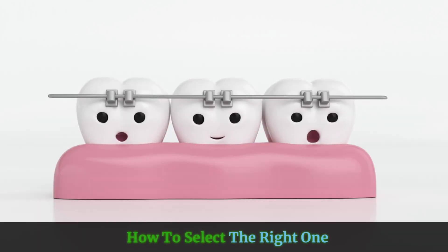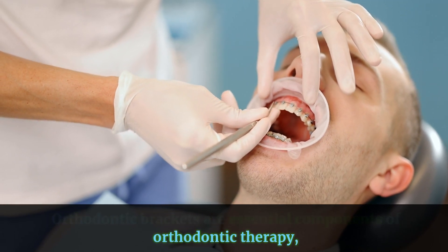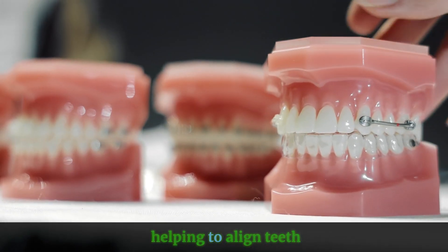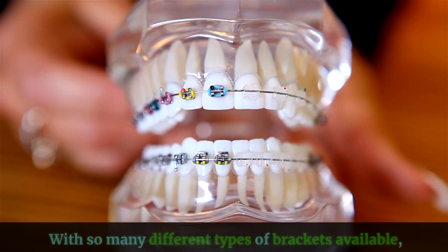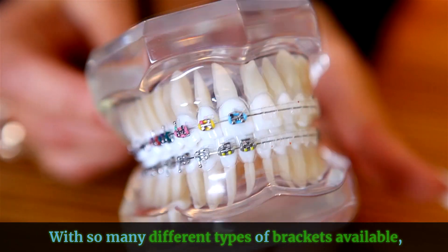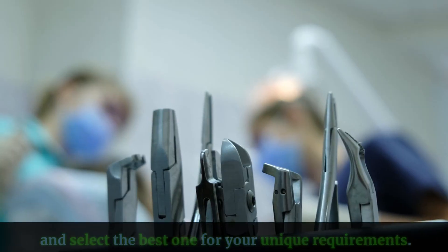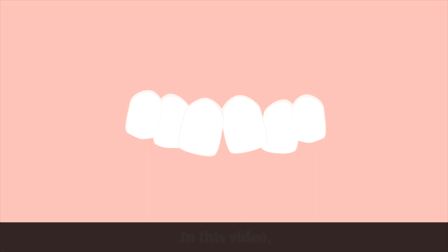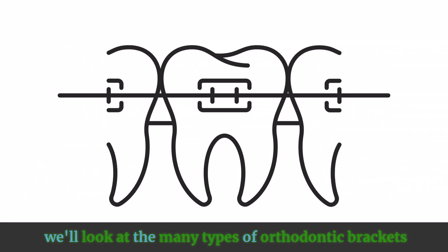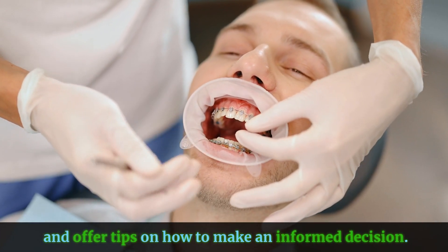Eight types of orthodontic brackets and how to select the right one. Orthodontic brackets are essential components of orthodontic therapy, helping to align teeth and address bite abnormalities. With so many different types of brackets available, it's critical to grasp the distinctions and select the best one for your unique requirements. In this video, we'll look at the many types of orthodontic brackets and offer tips on how to make an informed decision.